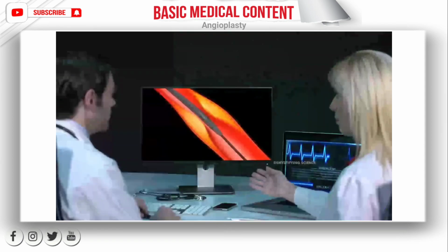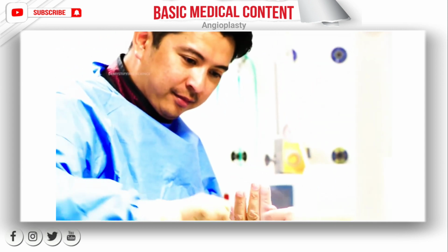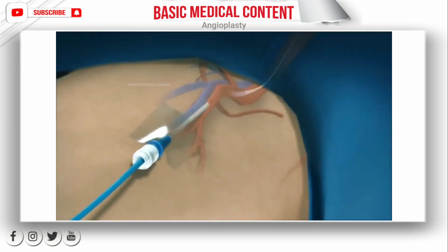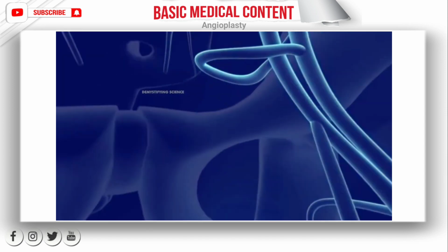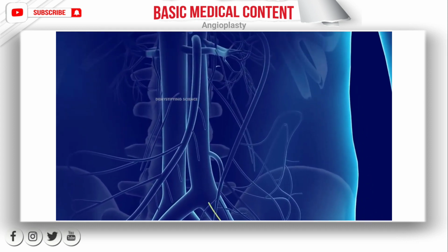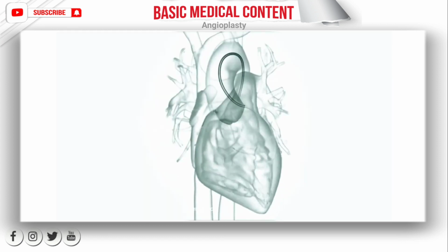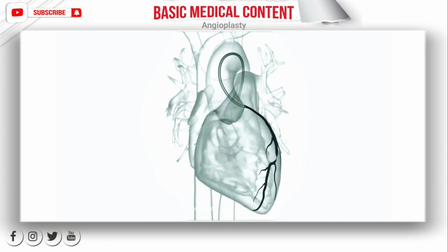Let us see how angioplasty is performed. Before beginning angioplasty, a healthcare professional will numb the area where the catheter enters the body, usually the groin but sometimes the wrist. Next, a doctor inserts the catheter into the artery and directs it towards the coronary artery, watching its progress on an X-ray feed.